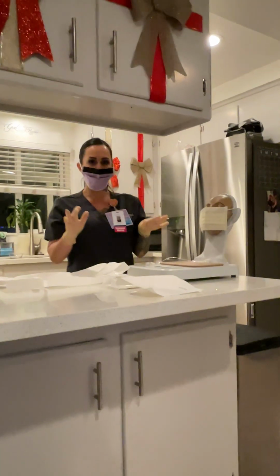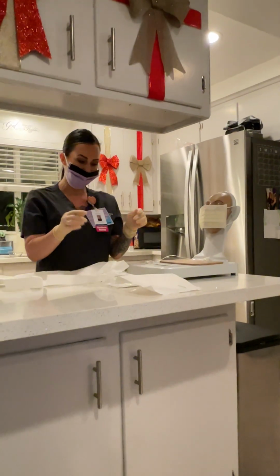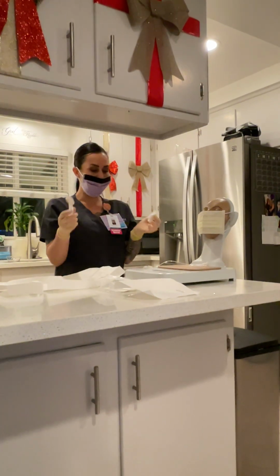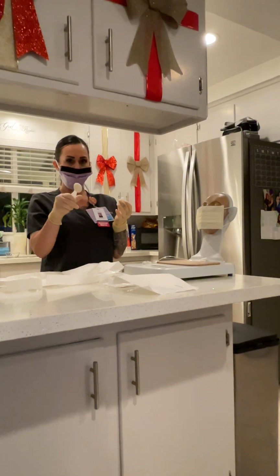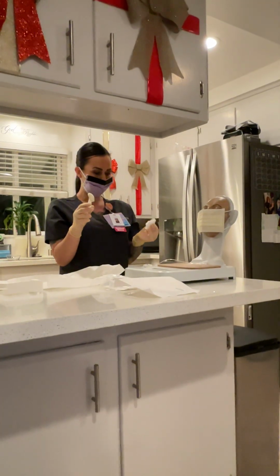Okay. Next, we are going to take our gauze and our chlorhexidine out of our kit. And since we are using chlorhexidine, we want to make sure that it's cracked. And we want to give it a second for the solution to fully saturate the sponge.